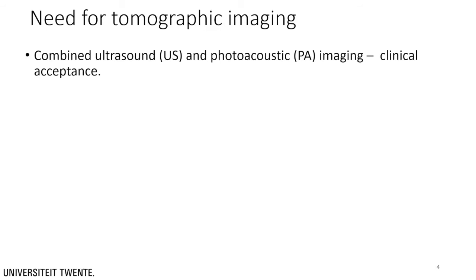Let's start by looking at one of the advantages of photoacoustic imaging. The ultrasound transducers used in photoacoustic imaging can also be used for ultrasound imaging. From a clinical perspective, this means that photoacoustic imaging can be typically used in applications where ultrasound imaging is already in use. An interesting aspect is that by simply plugging in a pulse light source, conventional ultrasound imaging systems can be converted into photoacoustic systems.